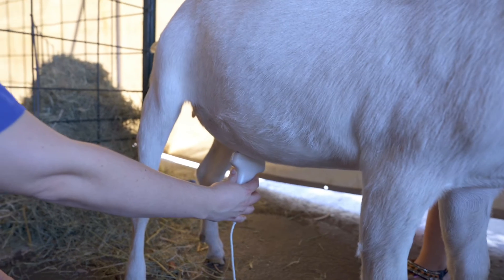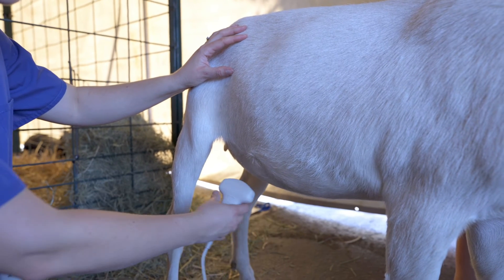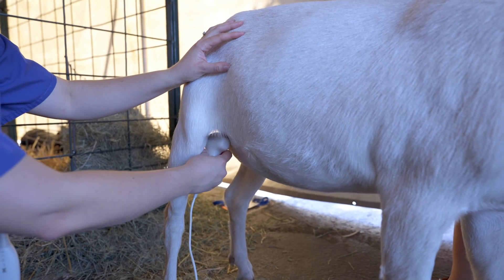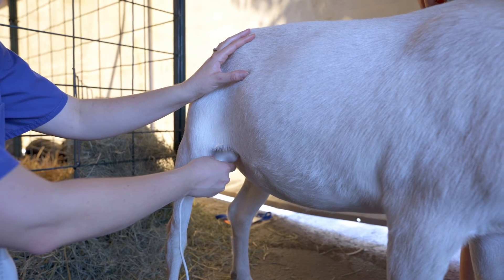From this position I'm imagining that the uterus is going to be here, so I'm angling to point towards it. And if I was under the back leg, similarly I'm going to want to lift the tail of my probe and angle the transducer into her body to where I think her uterus will be.